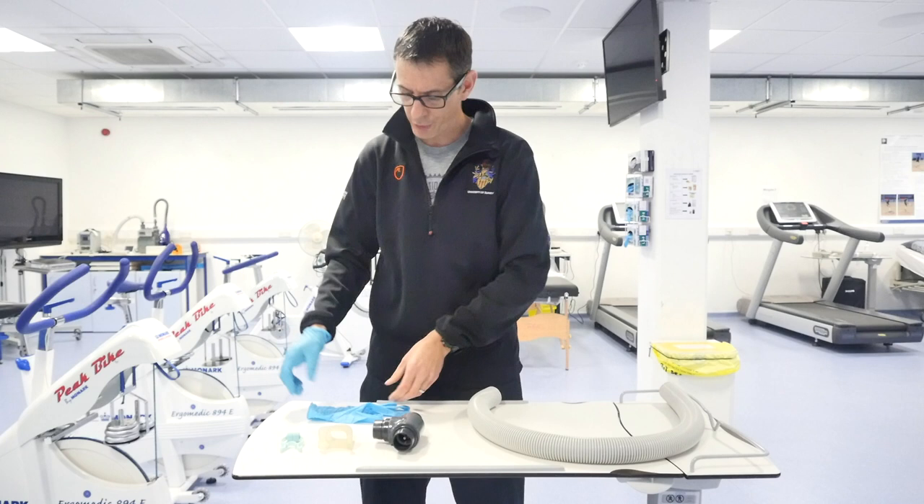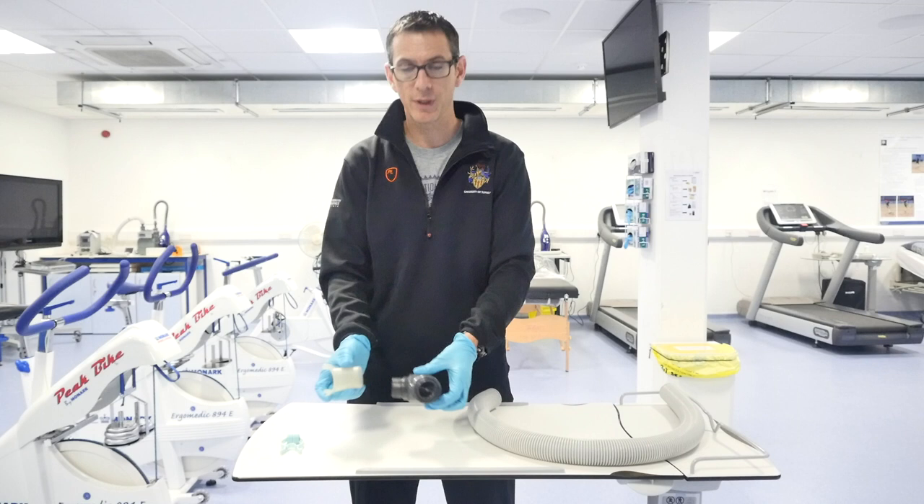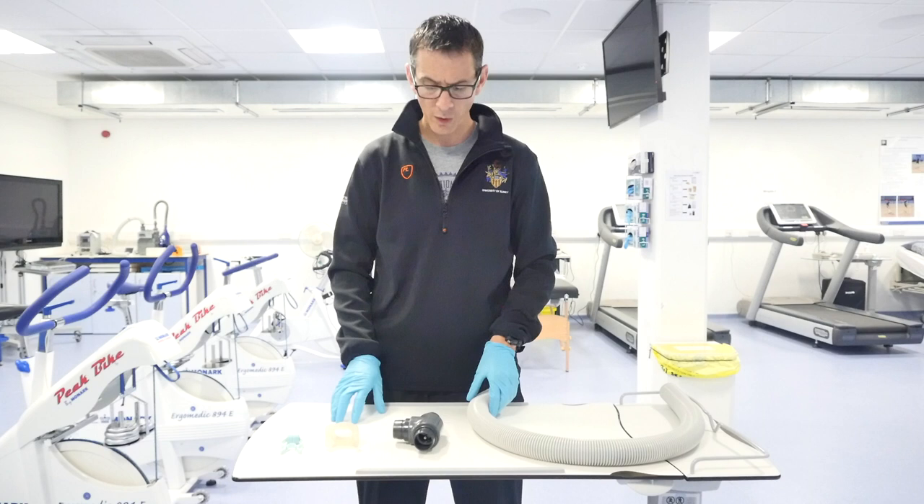The first thing I'm going to do is put my gloves on. I'd recommend we all wear gloves in this because we're going to be handling the mouthpiece. For hygiene reasons, it's important to make sure we always use gloves when we handle these, because we're going to put this together and then give it to the participant who's going to place it in their mouth.